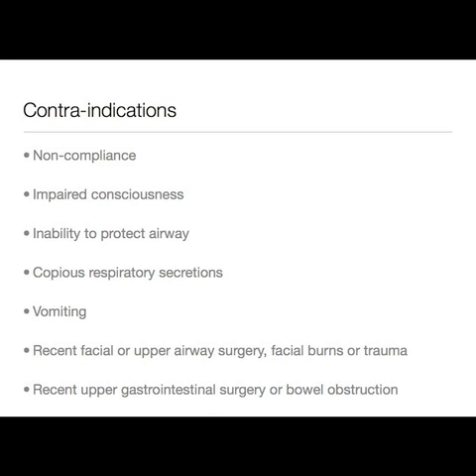Contraindications. Patients sometimes find NIV claustrophobic and uncomfortable, and they end up fighting with the ventilator rather than working with it. For this reason, they tire and become non-compliant, or they may even refuse to wear the mask in the first place.